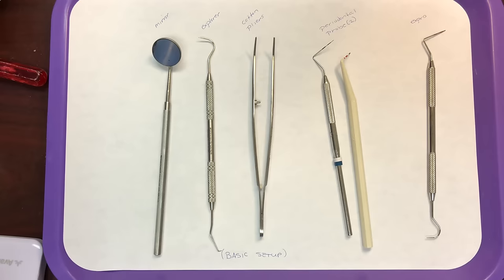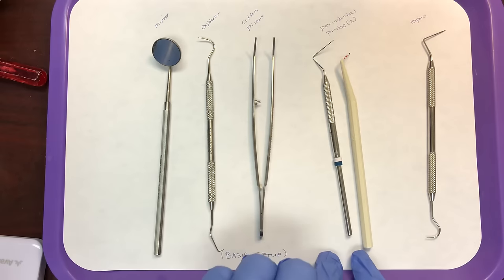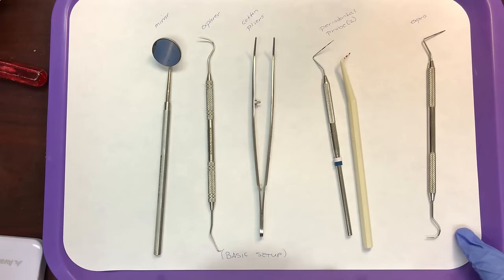These first three items — mirror, explorer, and cotton pliers — make up the basic setup and will be set out on every single tray. The other examination instruments put out on occasion for new patients or exams are periodontal probes or an x-pro.